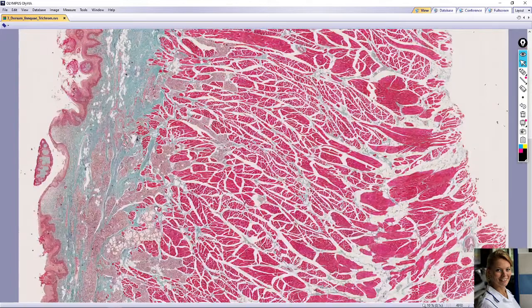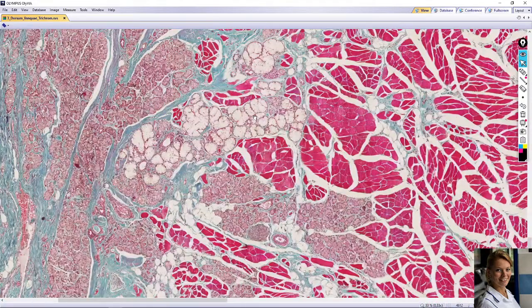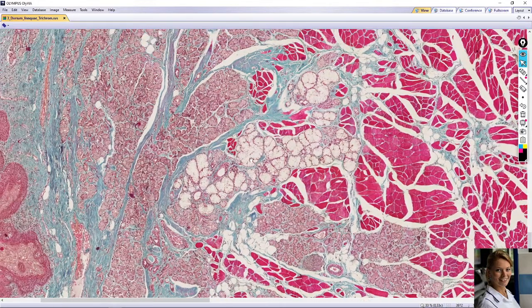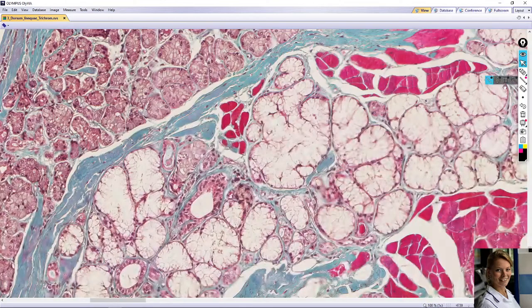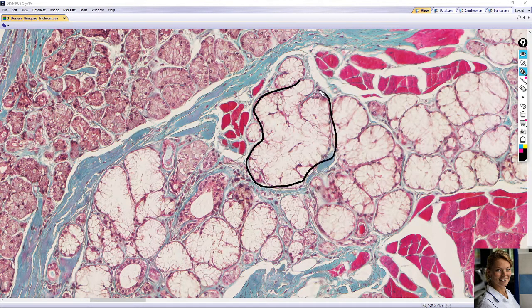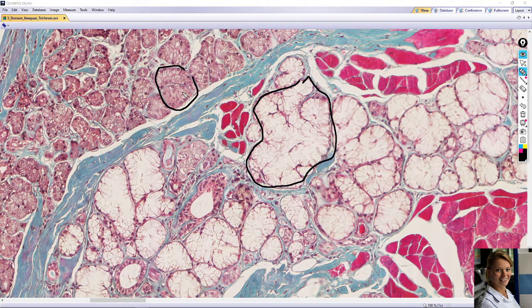Sometimes you can see mucous cells in the dorsal part of the tongue — for example, here. But mostly you can see serous cells. The mucous cells have a very pale cytoplasm full of mucus. The nuclei are flattened, squamous, and located at the periphery. The serous cells have round nuclei, and the cytoplasm of serous cells is darker.